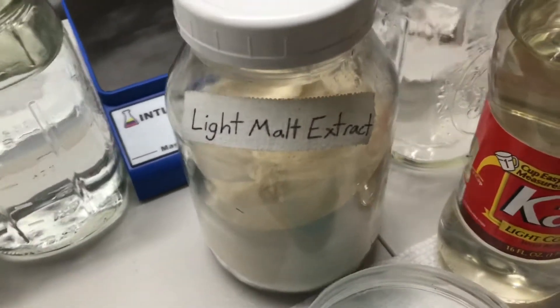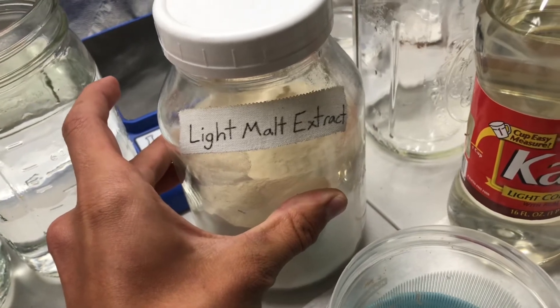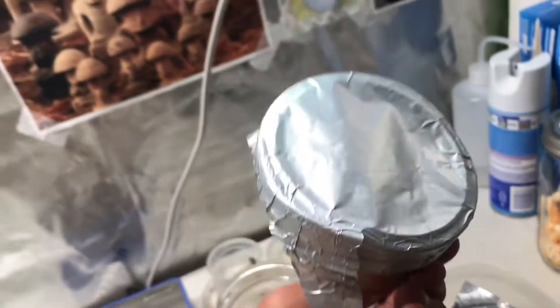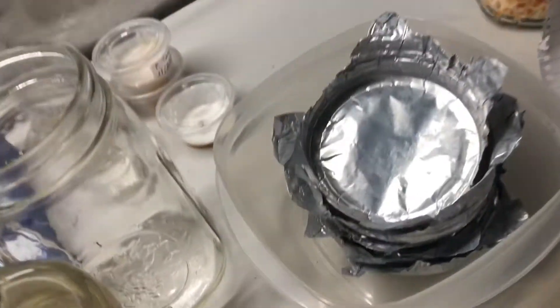Next up you'll need a sugar source. For the first recipe like I said there's malt extract, and then I also have this Karo, and then lastly I've got foil just to put on top of those jars whenever we go to pressure cook them.